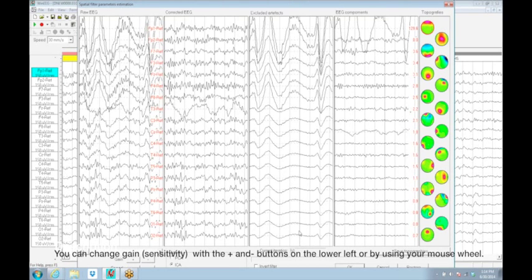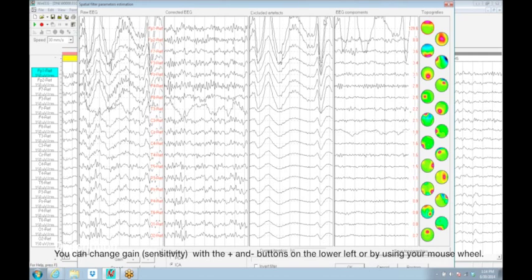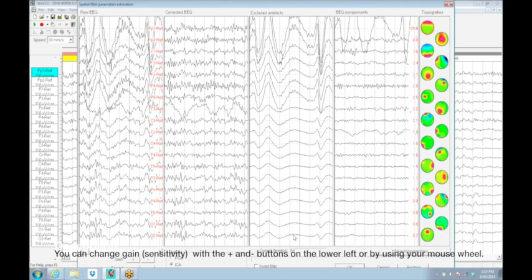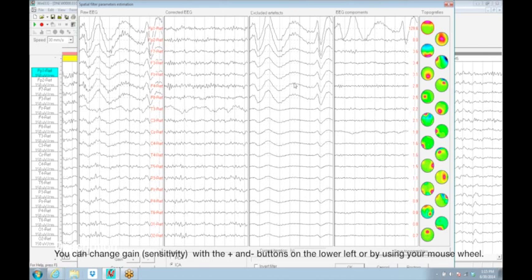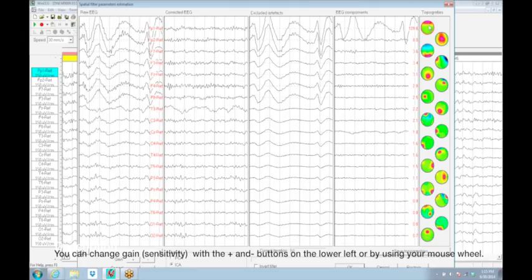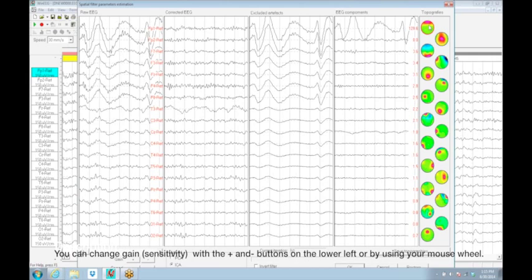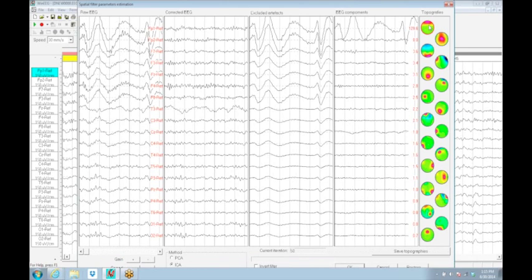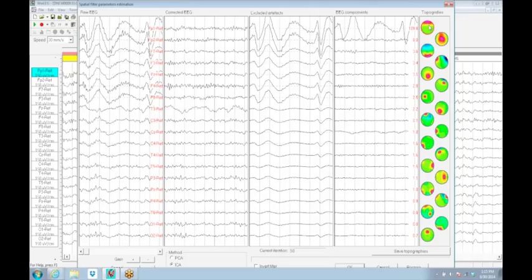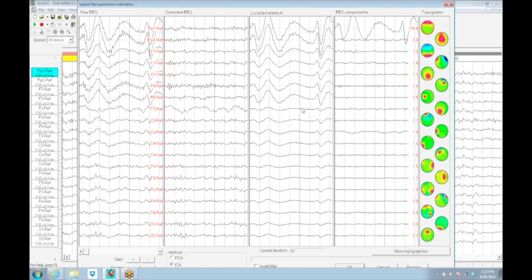If I turn up the sensitivity on this, the eye movement has to have a field from the front to the back with this orientation. Even these small ones have that same characteristic or they wouldn't be being pulled out. The component extraction of eye movement takes up more than eye blinks. It takes up small saccadic eye movements, the little tiny twitches that the eyes do in order to actually see. If your eyes didn't move continually, you'd end up with habituation. The ICA being extracted super cleans the EEG, even of the small saccadic eye movements, leaving the EEG minus the eye movements.